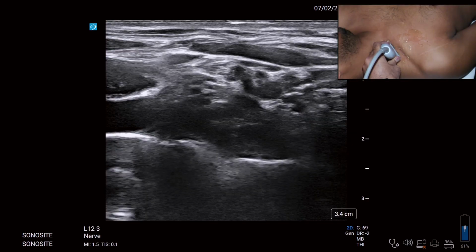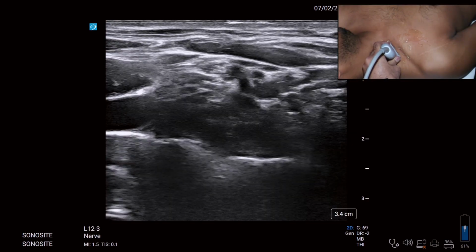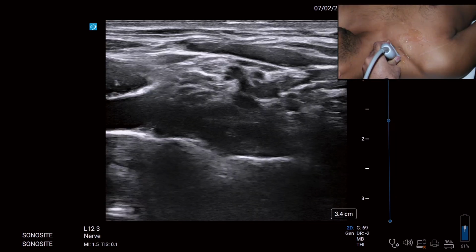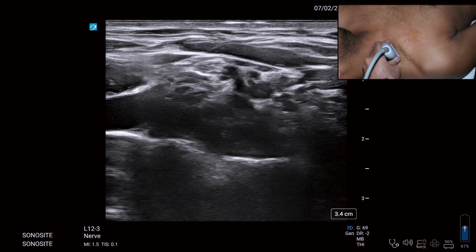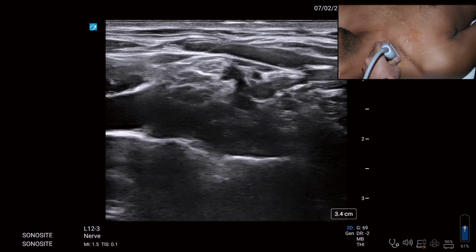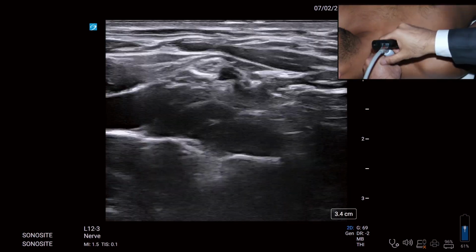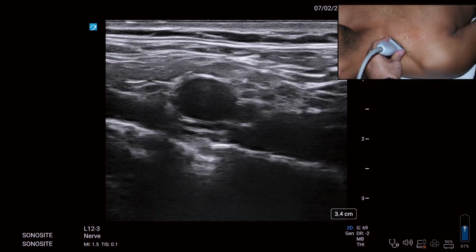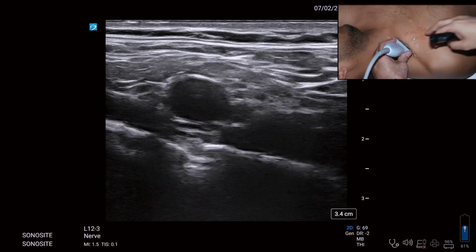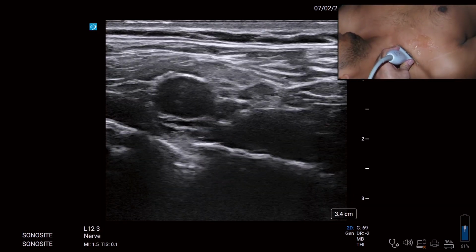Okay. So in upper limb, infraclavicular has been categorized as a deep block, thereby meaning what Dr. Manish is asking is, if you're having a patient on clopidogrel or warfarin, do not do an infraclavicular, whereas as an expert, I can do a supraclavicular or a costoclavicular. Is it okay? Okay, so I'll be scanning the classical bread and butter blocks, that is the brachial plexus above the clavicle. So I placed my probe in transverse oblique orientation, okay, just above the clavicle.